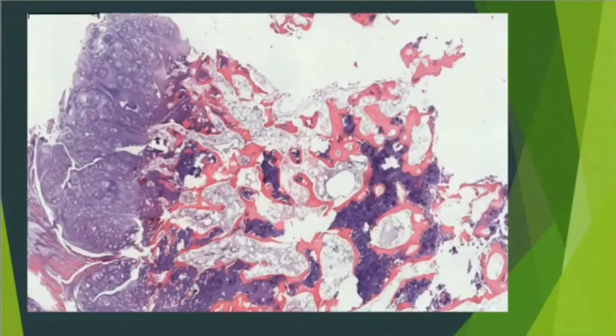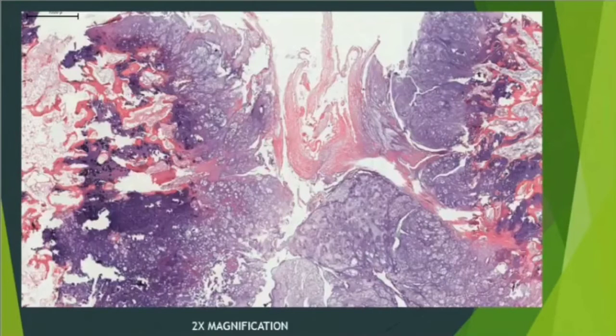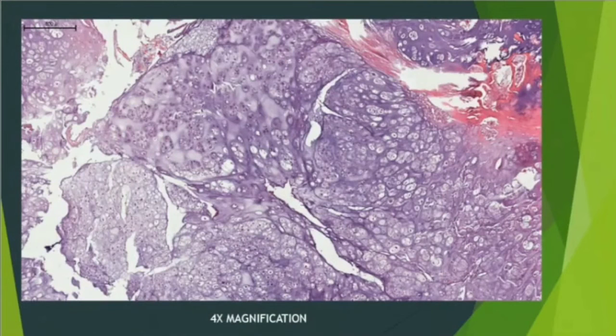This is a regular arrangement of the chondrocytes. There are 3 layers: perichondrium, the cartilage lobules, and the enchondral ossification and the underlying bone. This is the highly cellular area of the cartilage, showing irregular cartilage lobules. Another image of the highly cellular area.